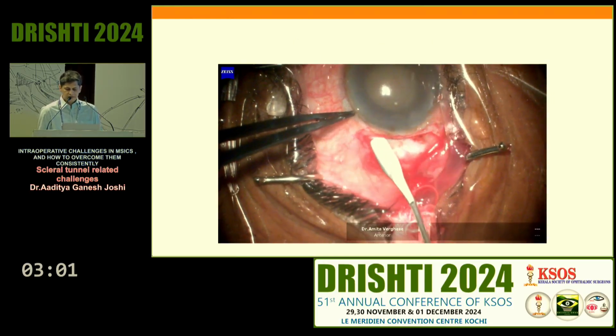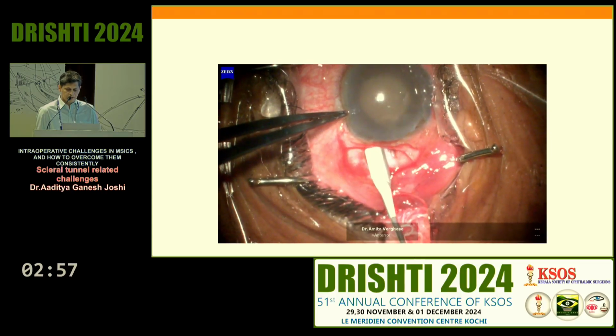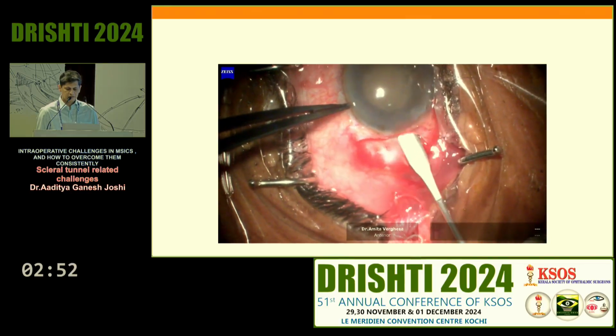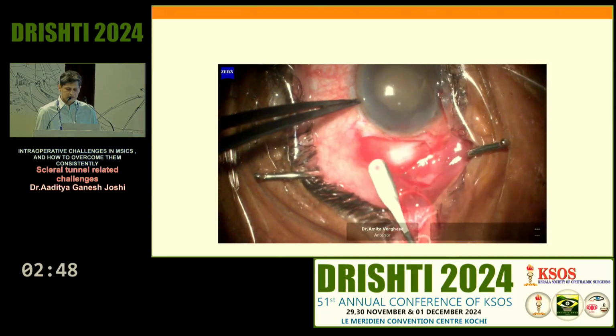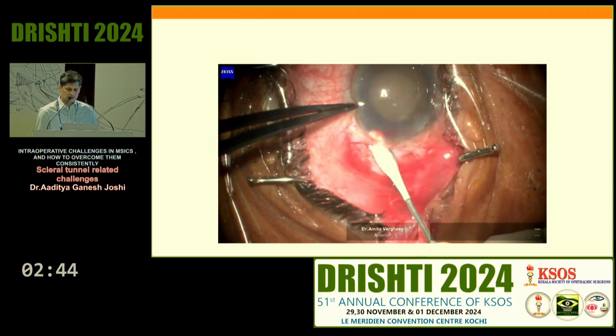In another place, the surgeon had this scleral flap cut as you saw over here. But then he was skilled enough, he went from the other side, got to the correct plane, and then he could negate this scleral flap cut so that it doesn't go through and through.